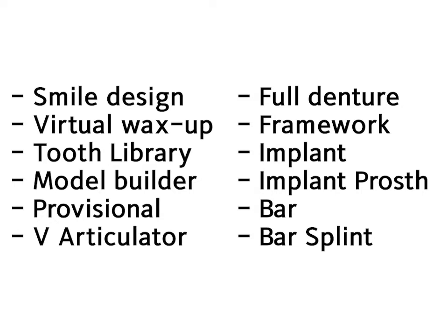The next one is the full denture. This type of module allows technicians to fabricate complete dentures digitally. The software can be used to design a denture base as well as other elements of the treatment such as the customized impression trays or base plates. It also allows to identify critical landmarks such as the alveolar ridge, the midline, and the occlusal planes, and so on, and would propose possible tooth setups that could be edited and ultimately exported for denture fabrication using 3D printers or milling units.